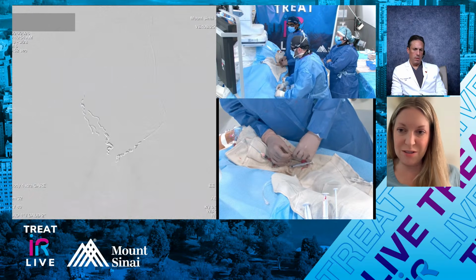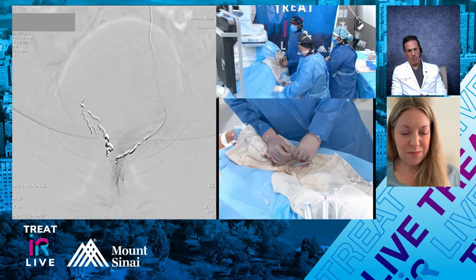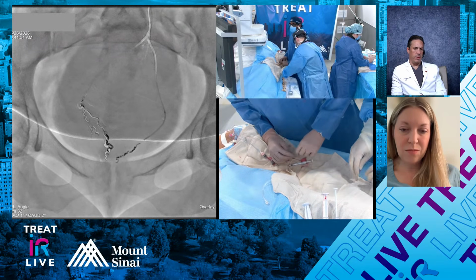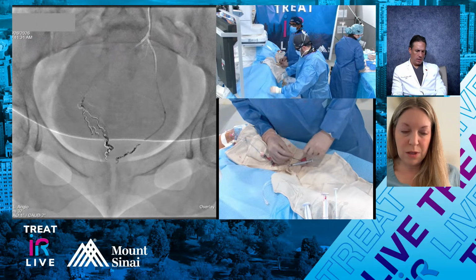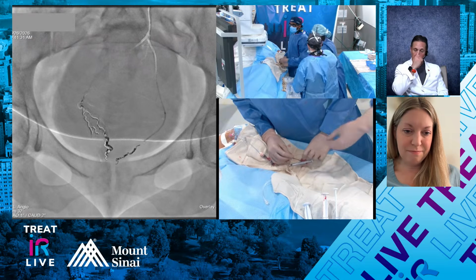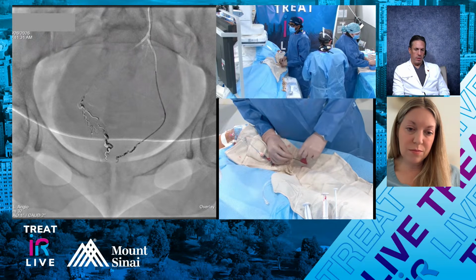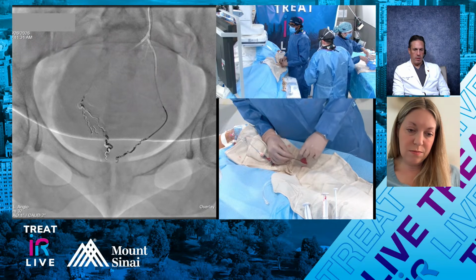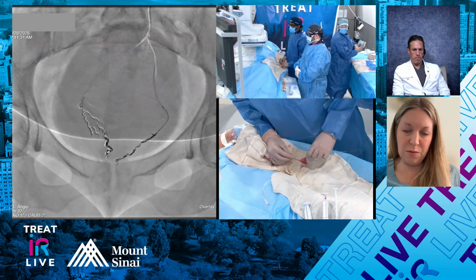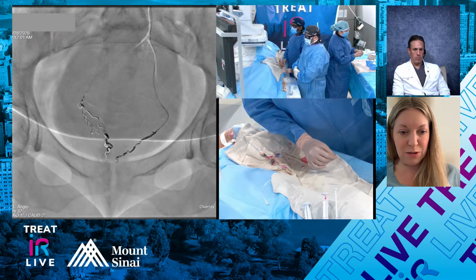The more you look, the more you find with these sometimes. But being able to see that amount of blush, even after embolizing 3 separate vessels, just reemphasizes the point that this territory is so vascularized, probably more so than any other vascular bed that we work in, maybe minus the stomach, which makes it challenging. I mean, this is why this procedure is hard. The microcatheter work is not always the challenge. It's finding all these vessels that can be the hard part. It's challenging, but it also makes it possible, makes it safe. It's the good and the bad of the collaterals, right?